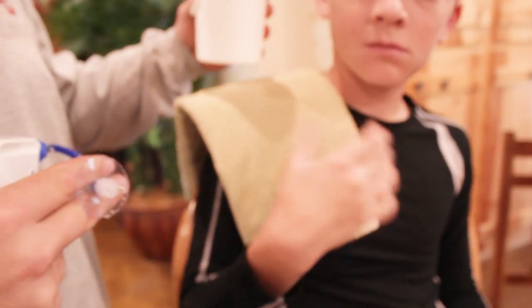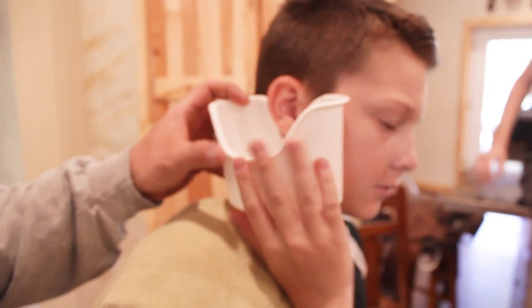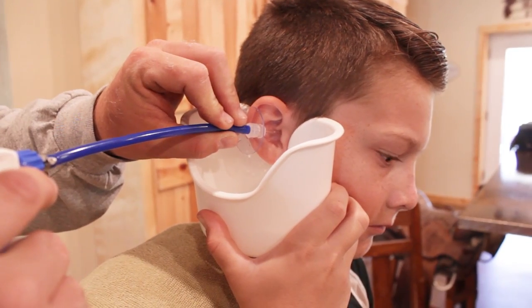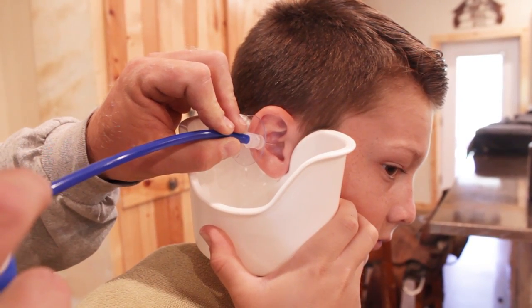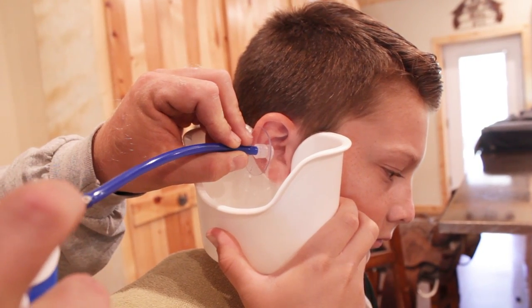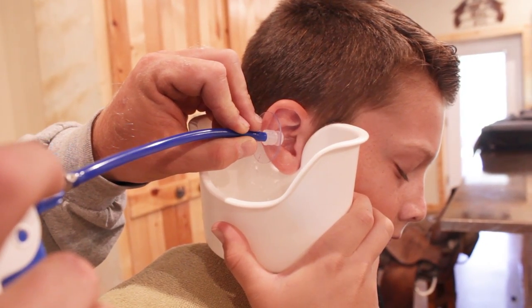We're going to switch ears now. We've got a little more than half left over, so we try to use one bottle per kid per set of ears. We put it in his ear. We just slowly start spraying. If there's any discomfort, they'll tell me and we'll stop or fix it. But most of the time it's pretty good — it doesn't seem to hurt them. It might be a little awkward at first because you're kind of pressure washing your eardrum.